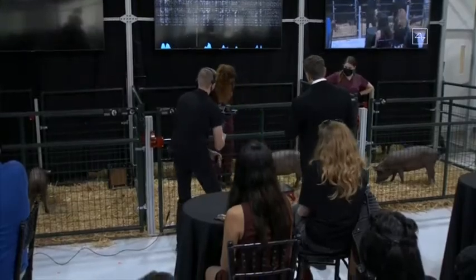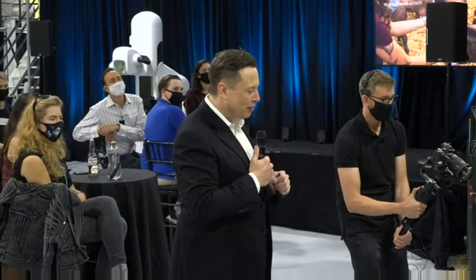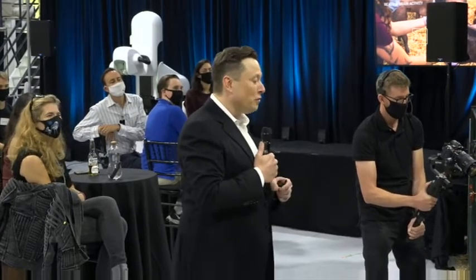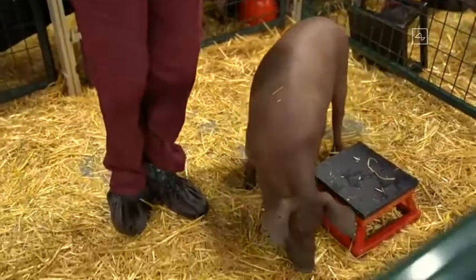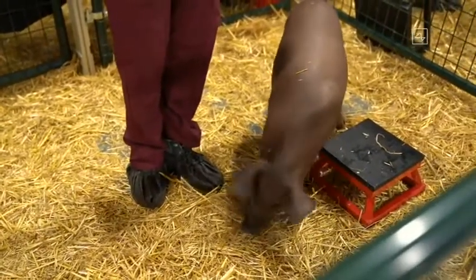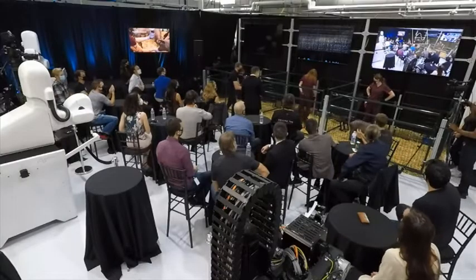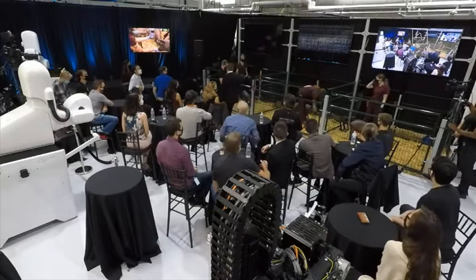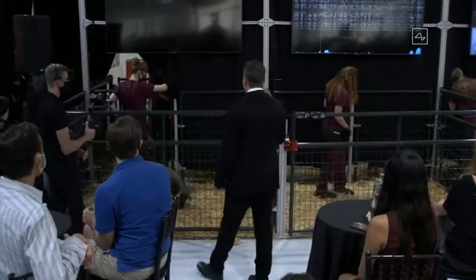All right, cool. So as you can see, we have a healthy and happy pig - initially shy but obviously high-energy and kind of loving life. She's had the implant for two months. So this is a healthy and happy pig with an implant that is two months old and working well.